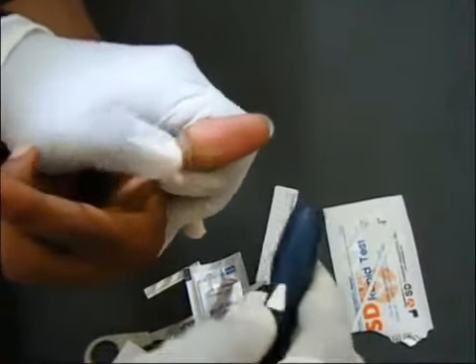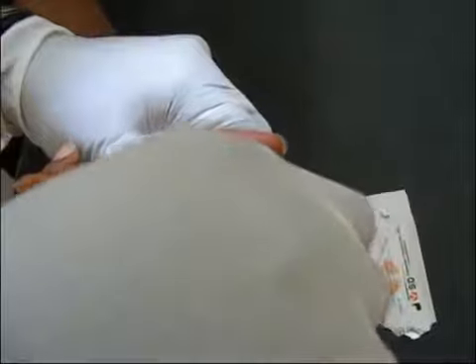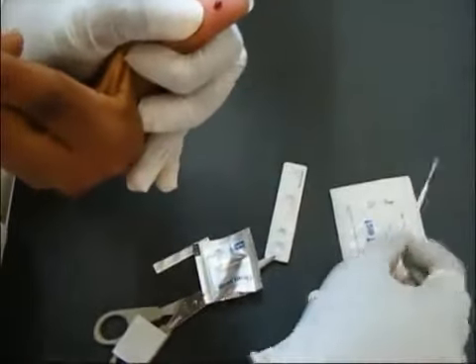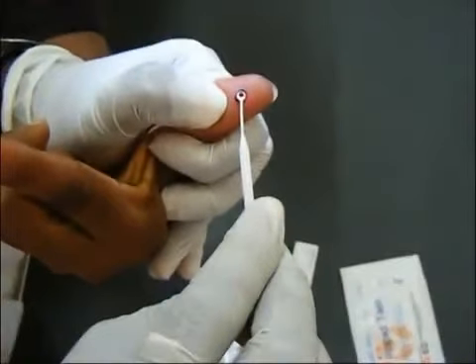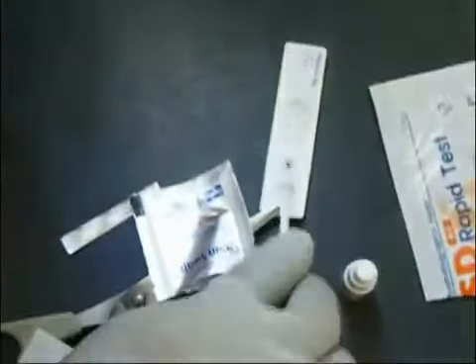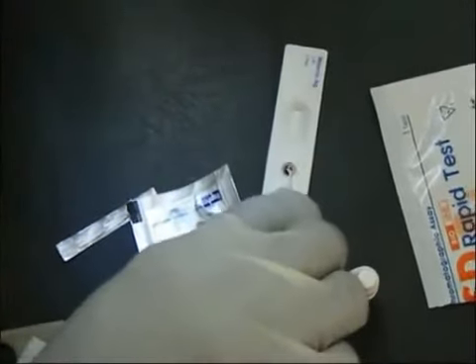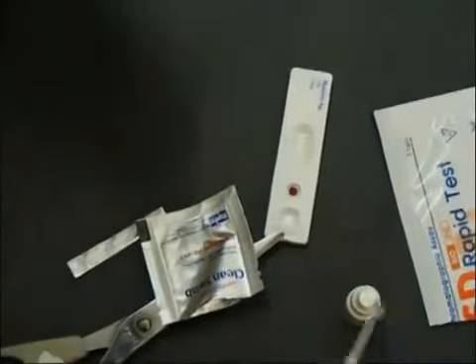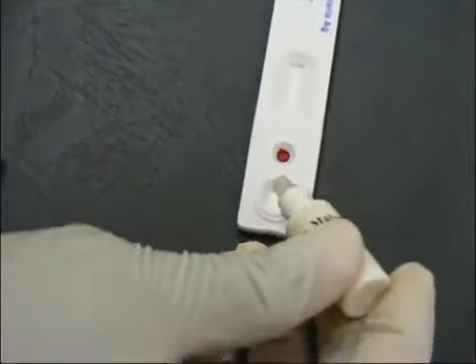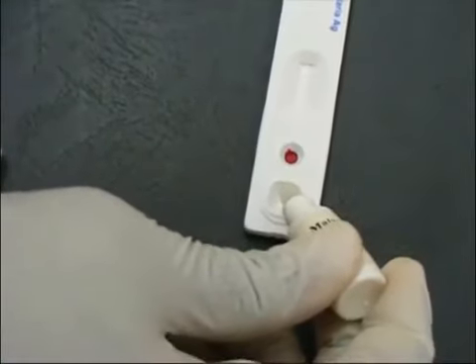The lancet is used to prick the tip of the thumb. And the blood is collected with a disposable sample applicator and put into the sample well of the test device. 2 drops of the assay diluent are dropped into the other sample well, and the device is allowed to develop.